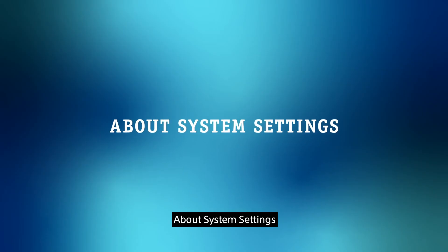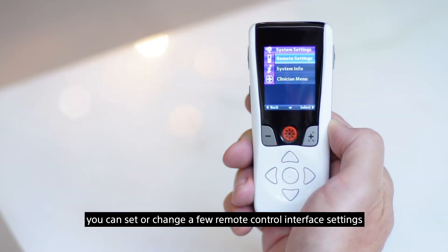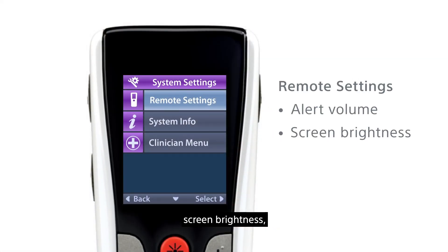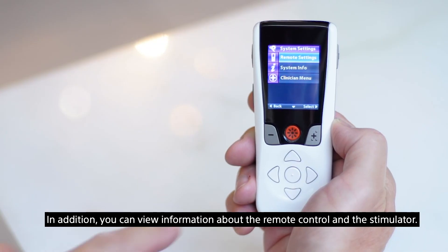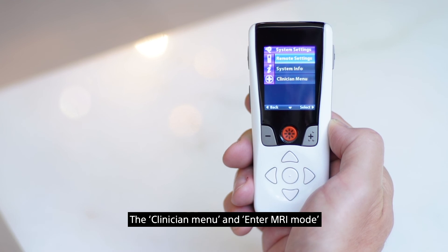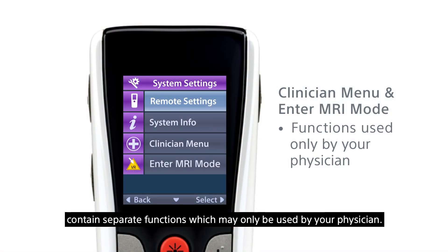Using the system settings, you can set or change a few remote control interface settings such as the alert volume, screen brightness, and the language setting. In addition, you can view information about the remote control and the stimulator. The clinician menu and MRI mode contain separate functions which may only be used by your physician.